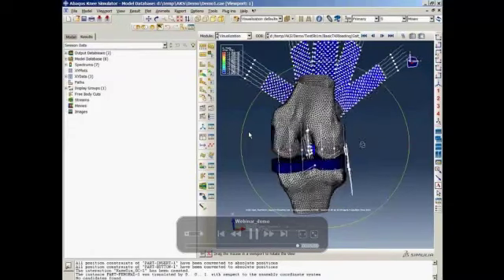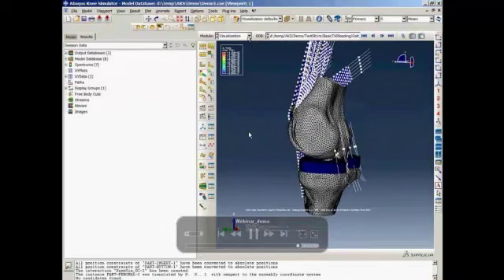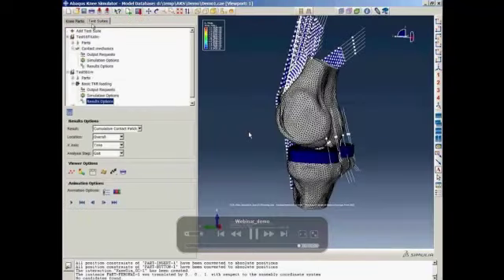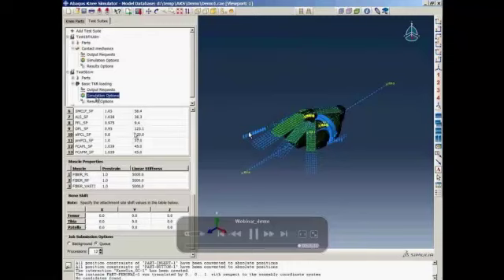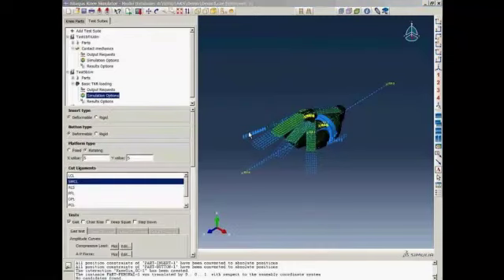To check that, it's really easy. I just went back to the knee simulator in this case, and I could choose to go back to designer view. Actually, I could stay in analyst view. I could still check what simulation options she has used. In this case, indeed, she has turned off the MCL from the model. So that concludes the demonstration.